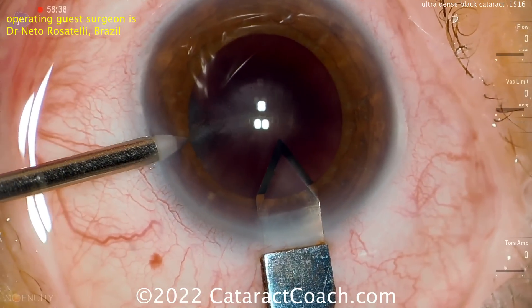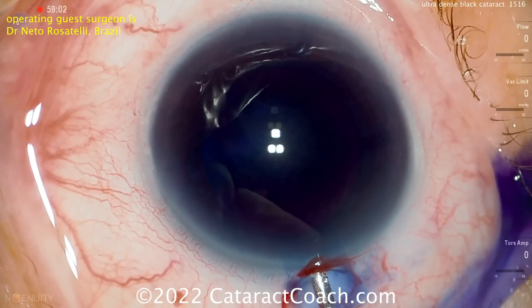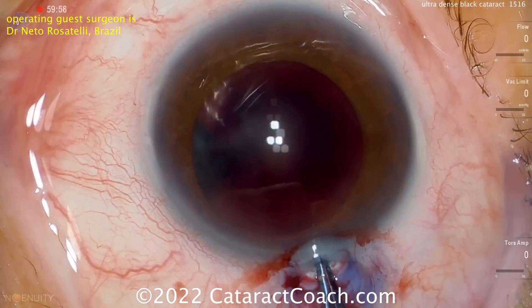A diamond keratome is being used to make the main incision, and there's the side port as well. You can see what a minimal red reflex there is. Trypan blue dye going in, and now filling up the eye with dispersive viscoelastic. Really tough to see here.